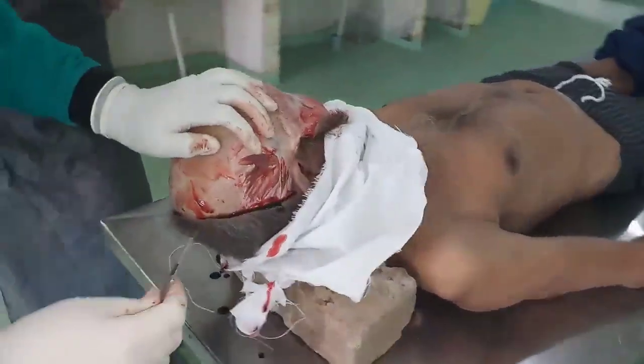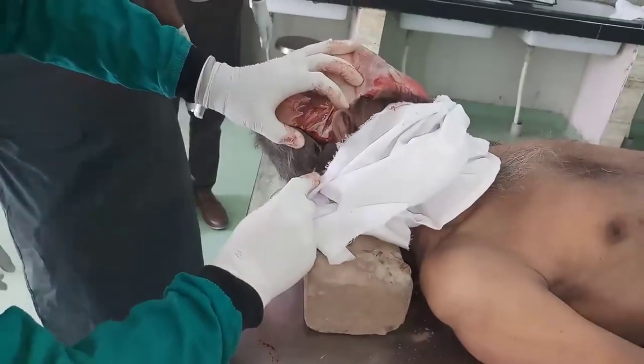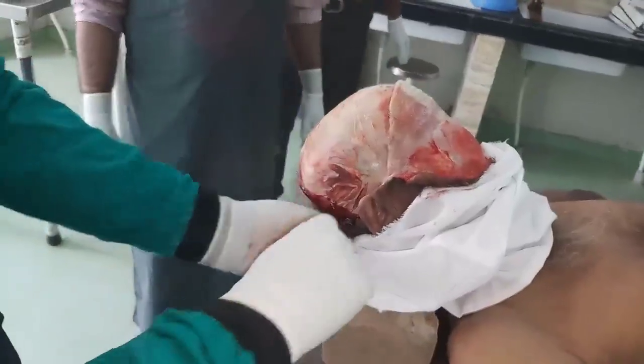Now we will retract the posterior flap. Again, just extend the incision just for ease of dissection.